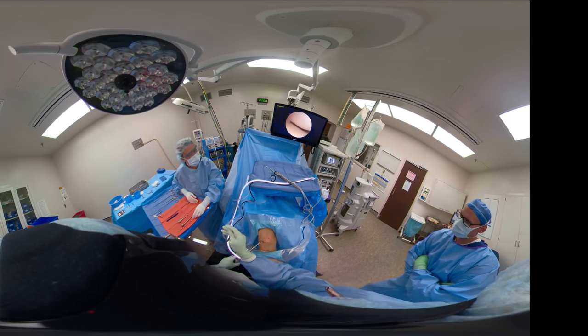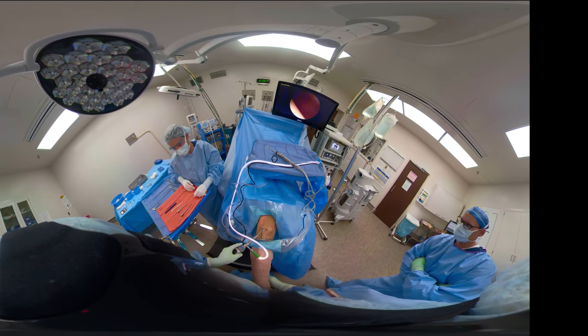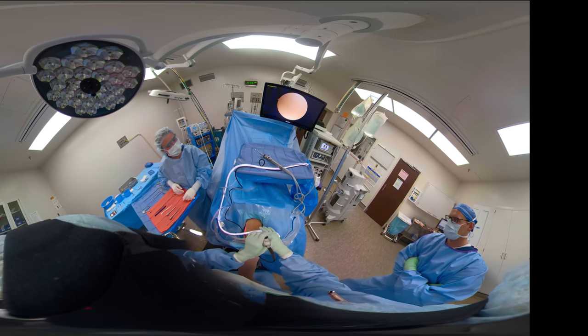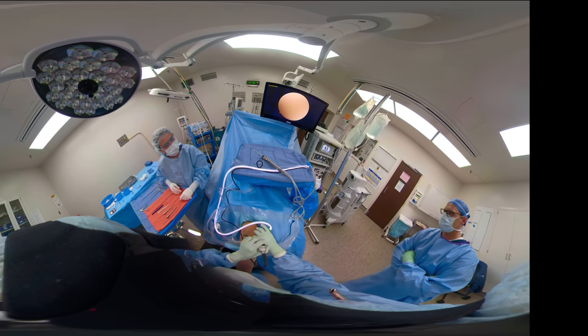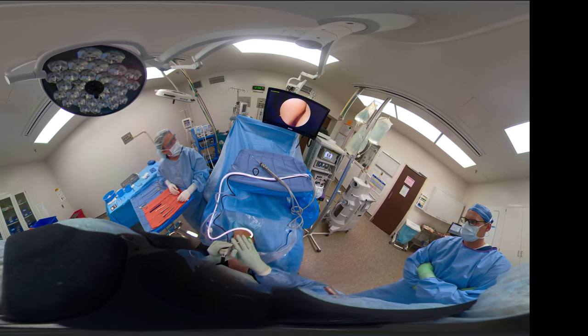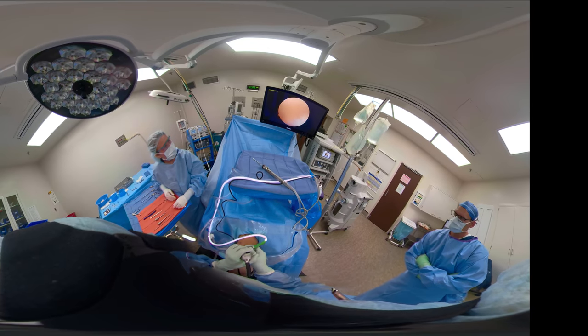trochlear groove. You can see where the position of our Mayo is, so we can grab that shaver if we need it. We need to be able to efficiently do arthroscopic surgery. The setup is key, and you can see the circulator over there has everything that we need. Not too much, but just enough so we can get at it.